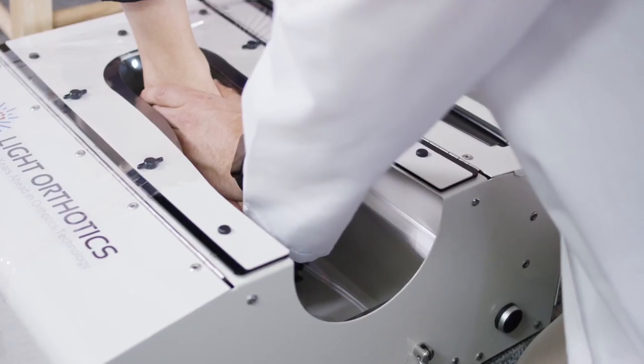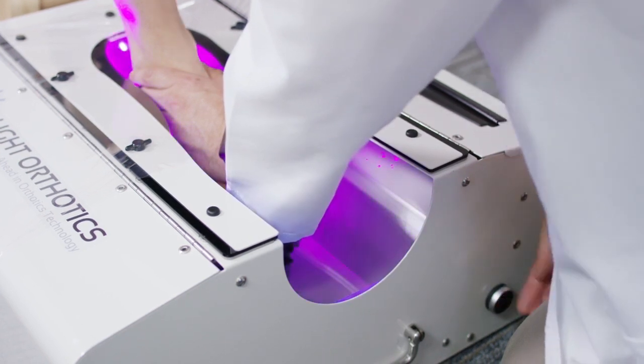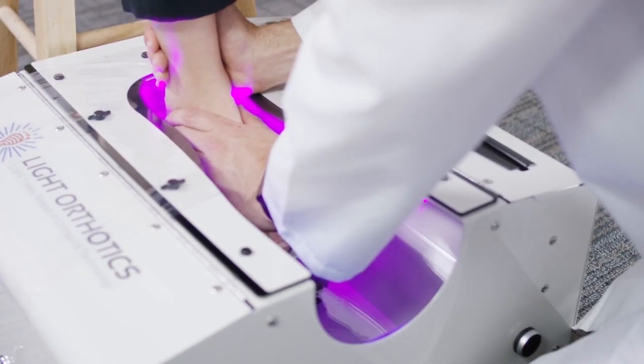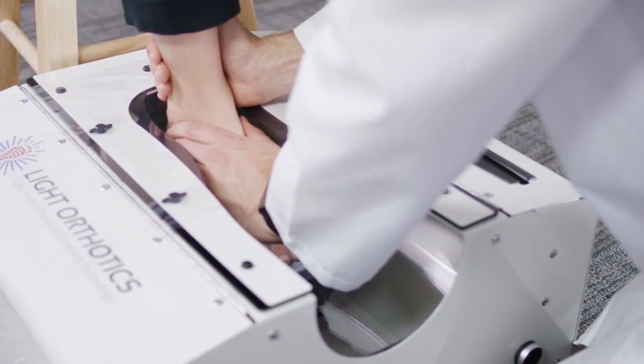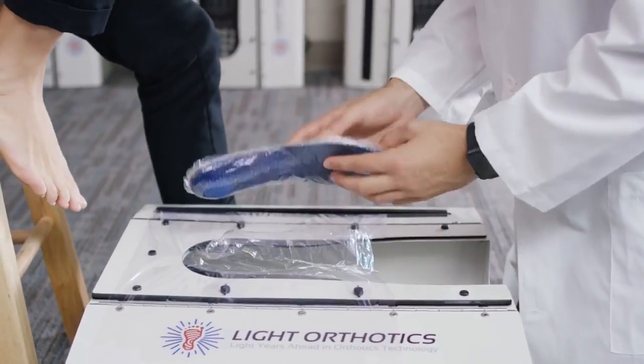Once the doctor or technician is satisfied with the position of the patient's foot, they activate the UV lights to begin the curing process. After approximately two minutes, the light curing process is complete and the pre-thodic is now a custom molded orthotic ready to put in a patient's shoe.